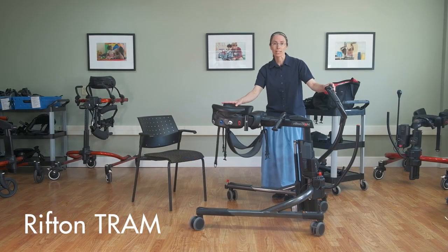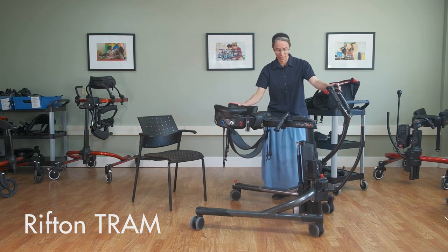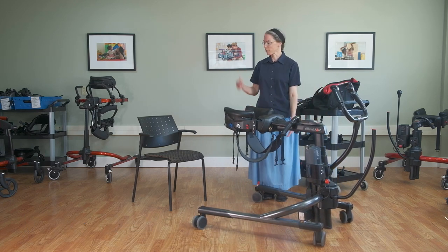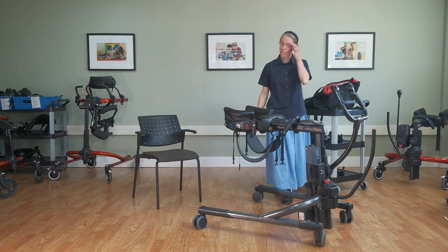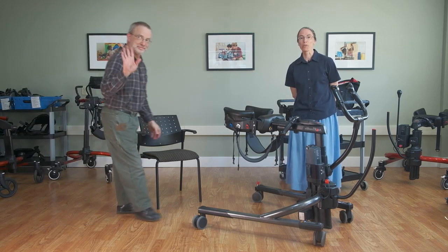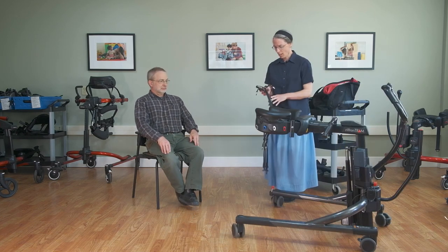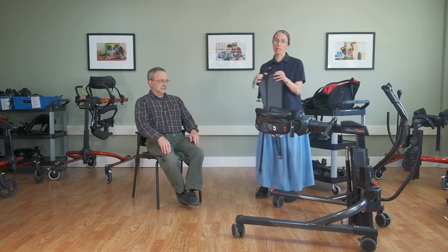This one product can do seated transfers and it can also do supported ambulation. We're very honored today to have someone from the Rifton design team who also works in product manufacturing — Sam Durgan — and he will be modeling to help us demonstrate how the TRAM works.